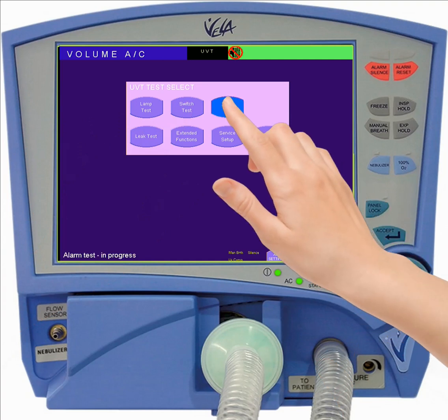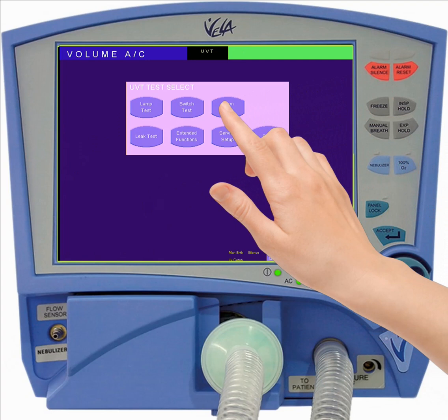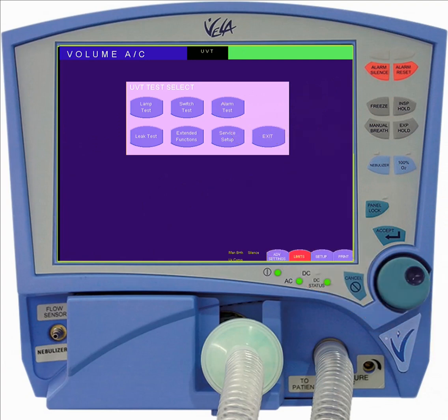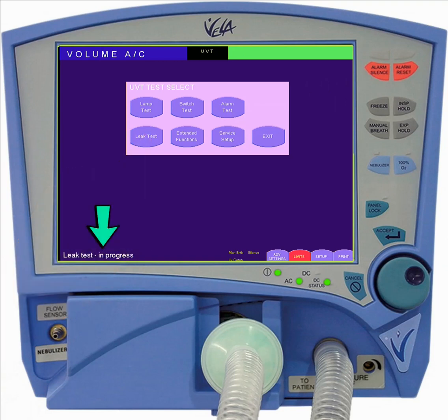The alarm test allows you to confirm the functioning of the audible alarm. The leak test pressurizes the circuit to test for leaks. You must have the patient Y occluded or connected to a rigid test lung to perform this test. A pass-fail message will be delivered in the lower left-hand corner of the display when the test is complete.